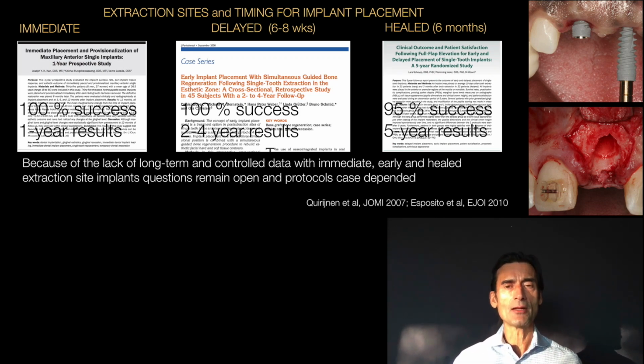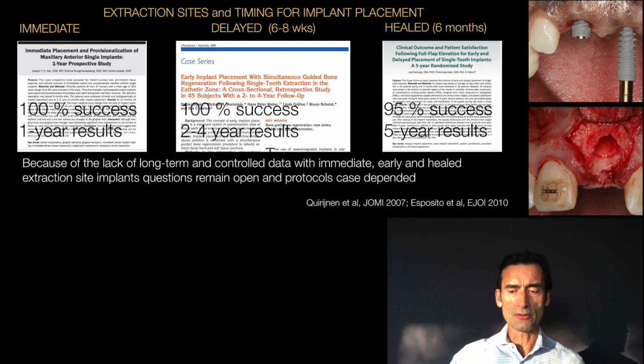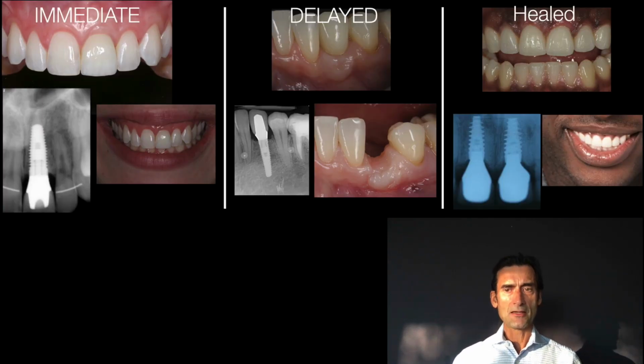And it depends really more on the case selection and what kind of protocol you will do. So you are the one who is in charge, and it's not that you're looking at an extraction and say, oh, I'm going to just place implants in every one because I have 100% success. No, it's really depending on the clinical condition.